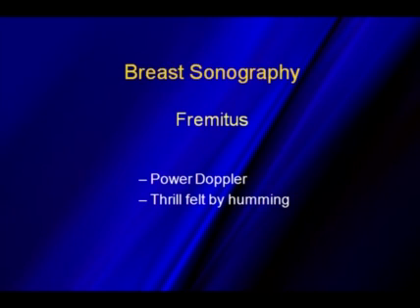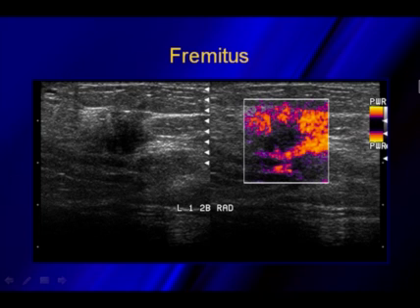One thing I found out, if they have a high-pitched voice, the humming doesn't work very well. They have to have a fairly low voice, hum fairly deep, and you're going to get much better results. If the humming doesn't work, what I'll have them do sometimes is clear their throat, and sometimes that will help a little bit.